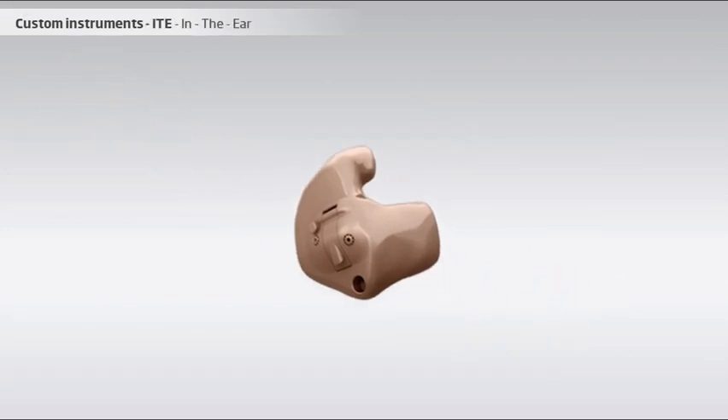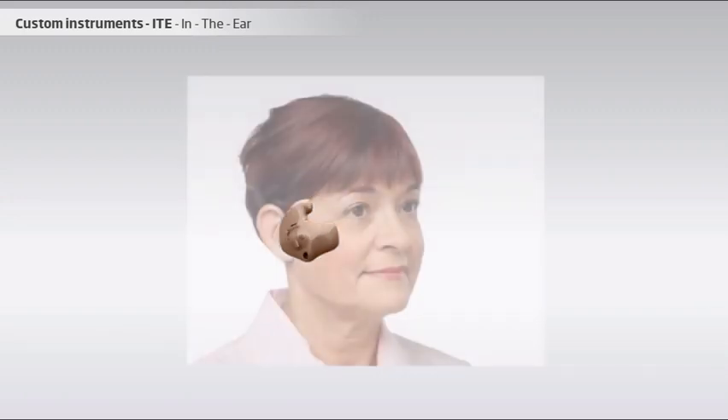The ITE instruments are relatively large instruments that fill out the ear canal and a significant part of the outer ear. Because of its size, this type of custom instrument can cover severe hearing losses and has high flexibility in terms of features. For example, the ITE may have room for functions such as a second microphone, push button for program change, volume wheel, etc.